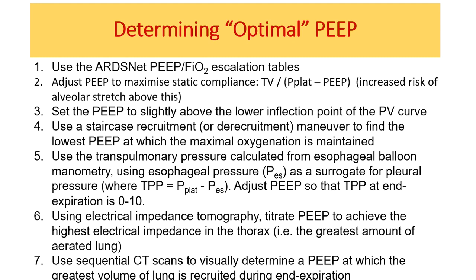You can also use electrical impedance tomography, and these are going beyond the range of what else. If somebody is constantly asking you silly questions and what else, you can always say electrical impedance tomography. I'm sure they would also not know what electrical impedance tomography is. Okay, so I'll tell you in a nutshell in case somebody wants to ask you further what that is.